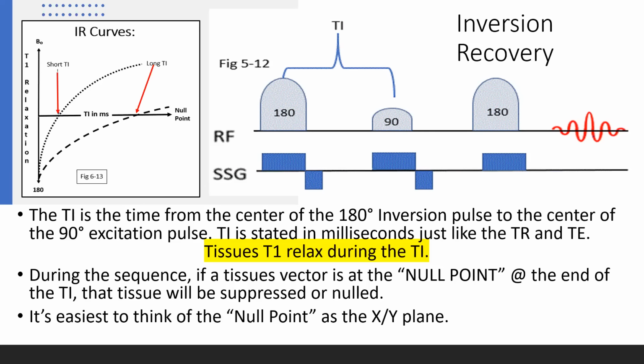So for example, you look at this curve, top left. Those basically look like T1 curves, do they not? Yeah, they do. Okay. What happens is the tissue's not starting to relax from the transverse plane, but it's starting to relax from the 180 down below.